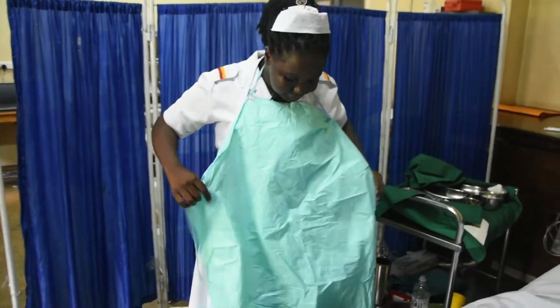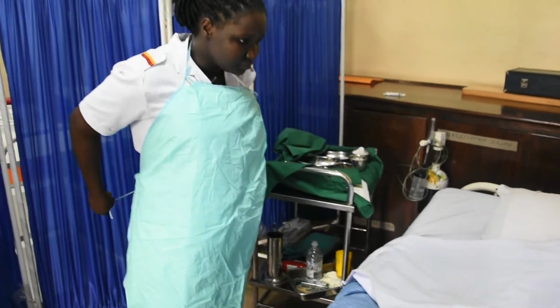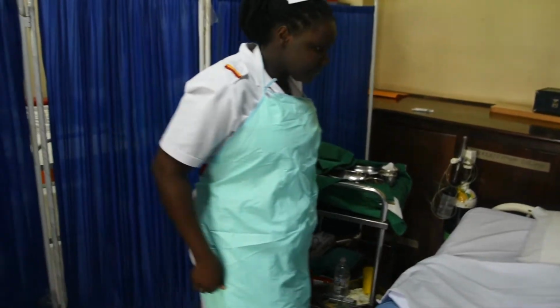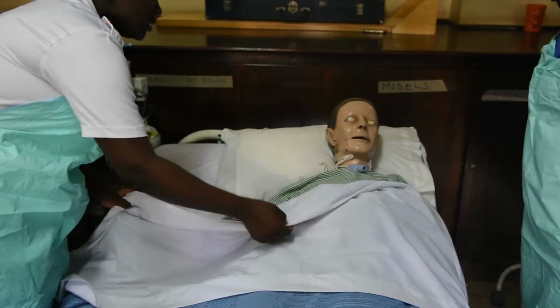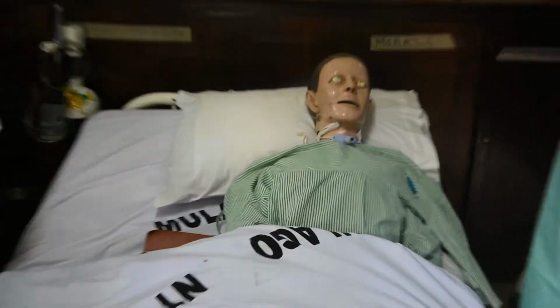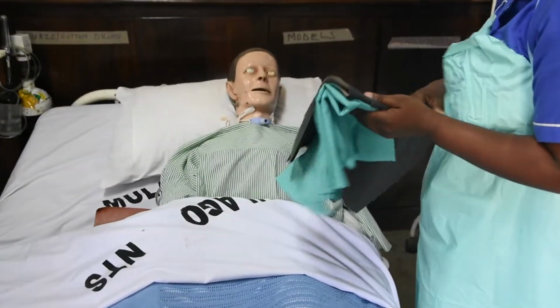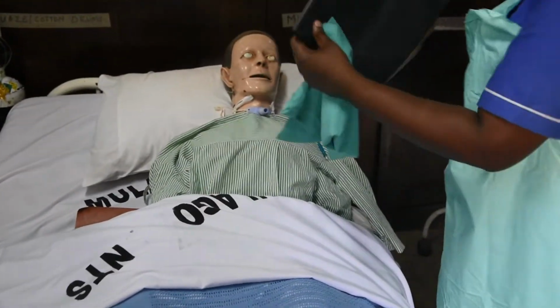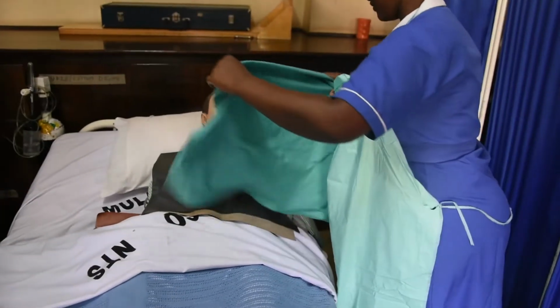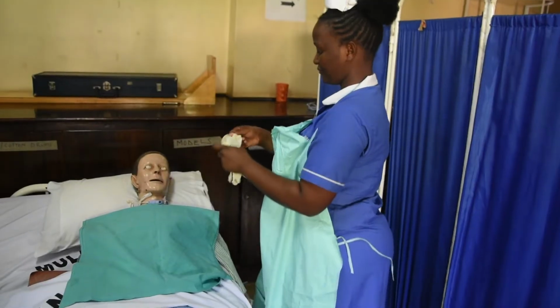Assistant, you can put on your apron. Mr. Mulago, don't worry, we are going to expose you a little. So you have to expose Mr. Mulago. Assistant, you can protect the patient's clothing.